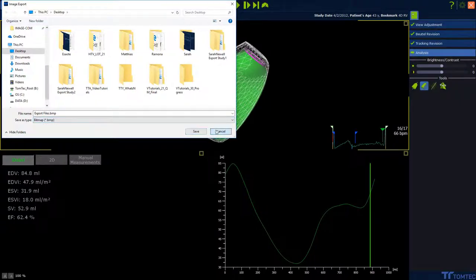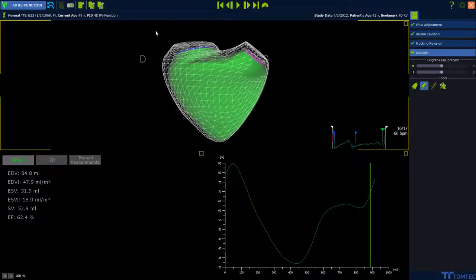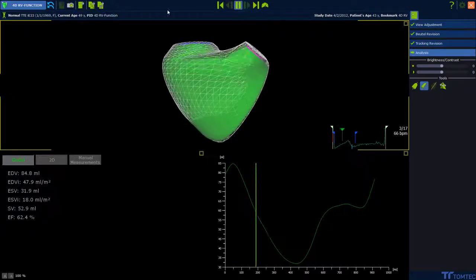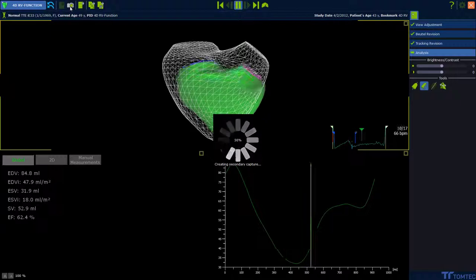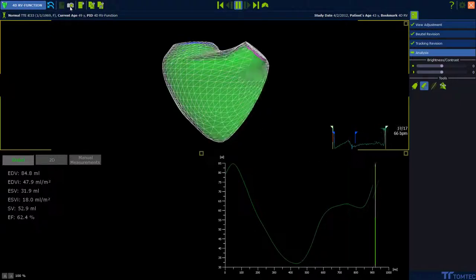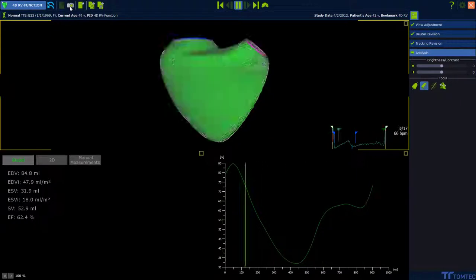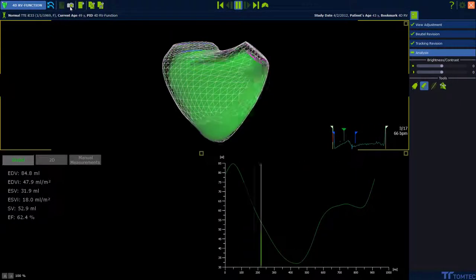Secondary capture is now the same as an image com. If you click on the secondary capture icon, we are producing a new DICOM file which is added to the end of the study.